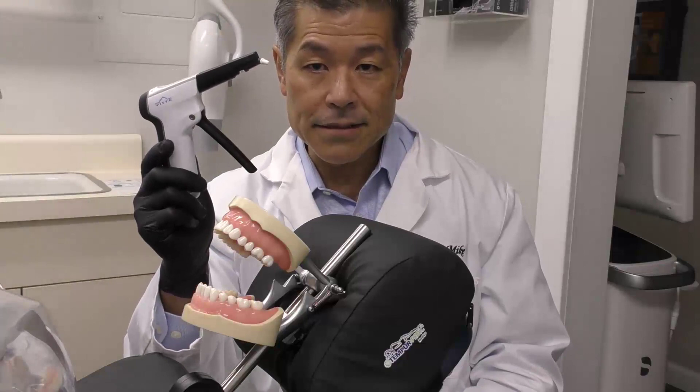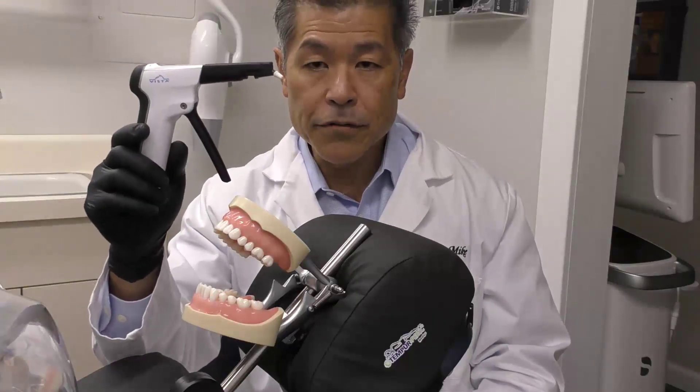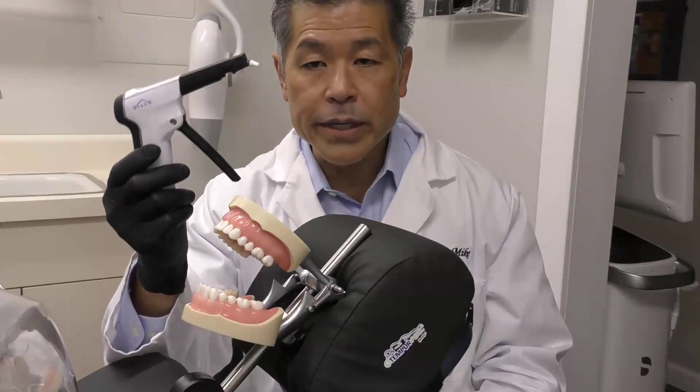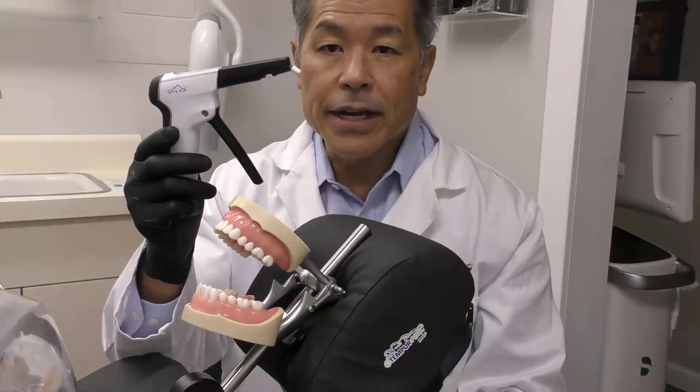We warm our composite. This is the Phaser composite warmer from Vista Apex. What we can do with the Phaser is we can quickly warm our compules of composite. Let me show you how that works.